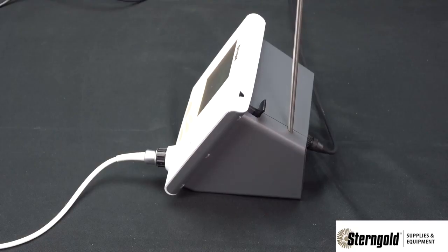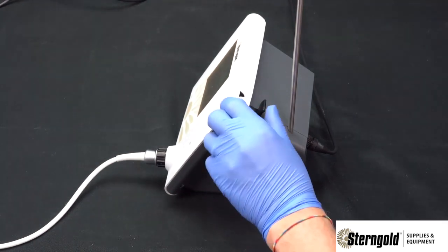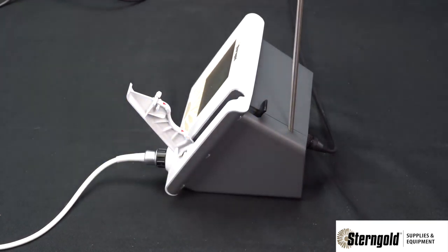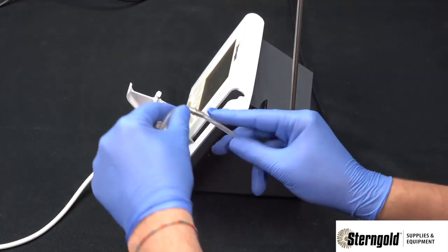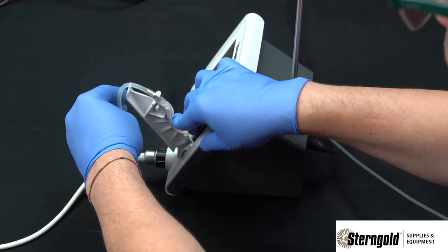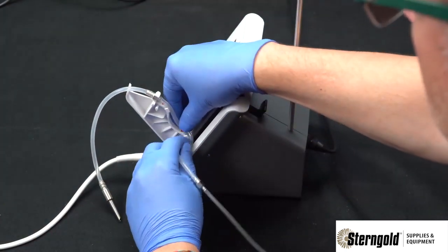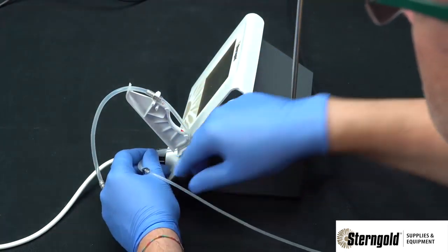Loading the pump mechanism is very easy. To release the door, press forward on the black tab and gently open the door to its open position. Take the first inline connector and set it inside the top slot of the pump door, then gently guide the tubing down with your finger.